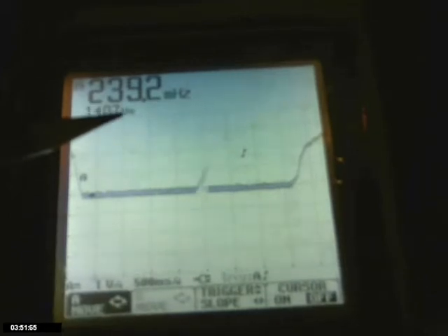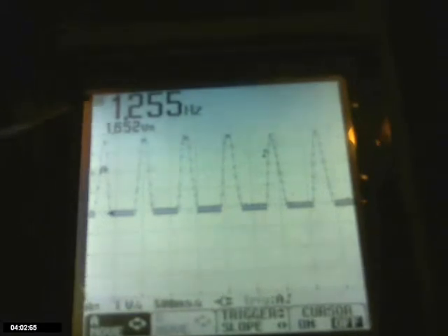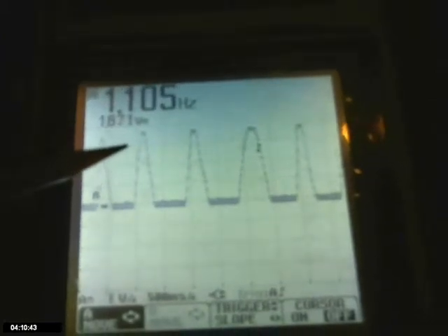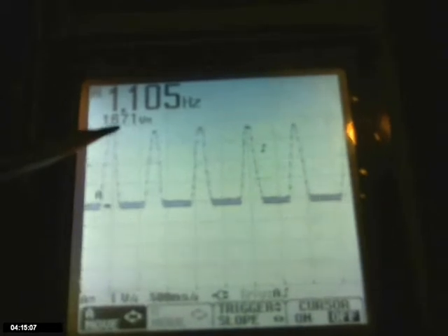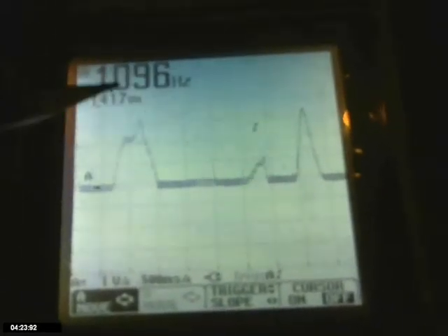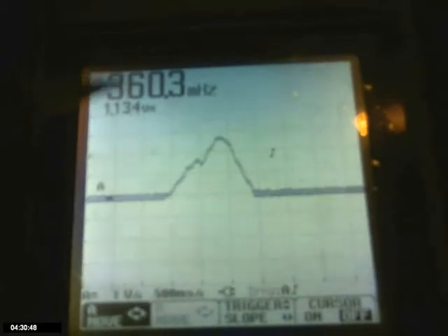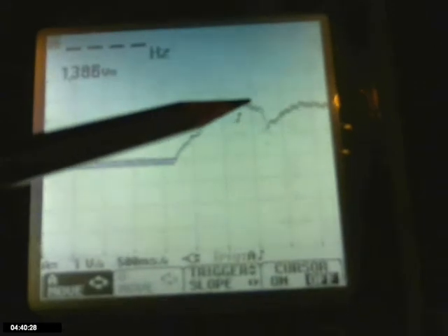And when you breathe faster, you see this is going pretty high, which means this is going to around 60 breaths a minute. And you have very nice periodic waveform showing that the driver has got a very fast breath, which is abnormal. You'll find this figure changing. That's around 18 breaths a minute, and you have very nice waves. This is you breathe in and you breathe out.